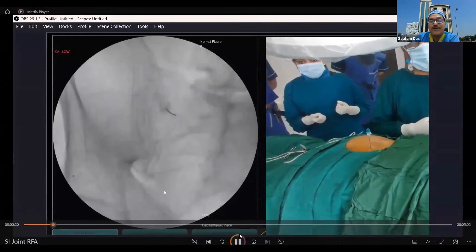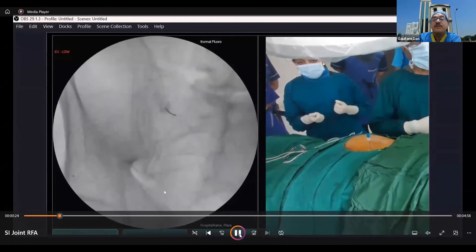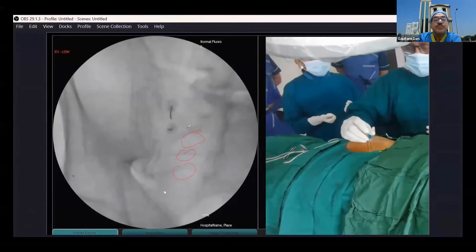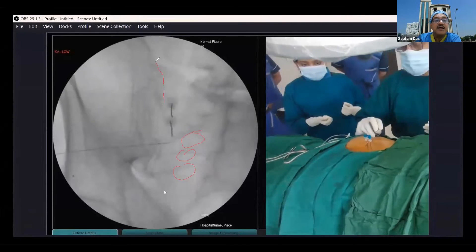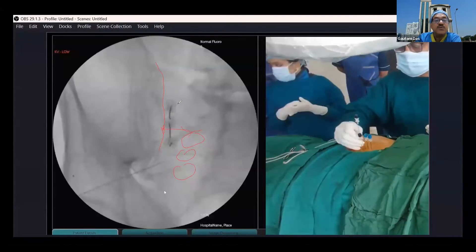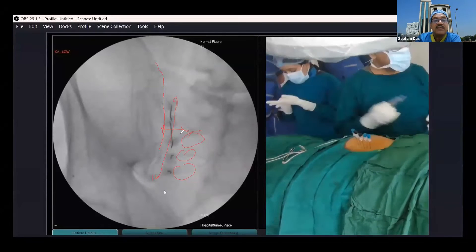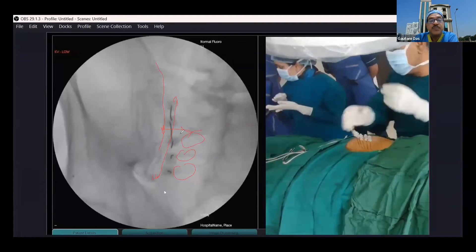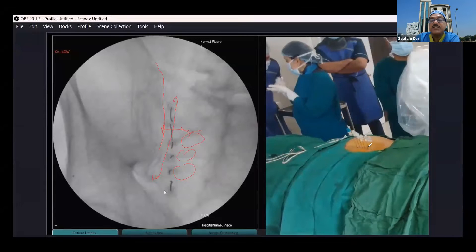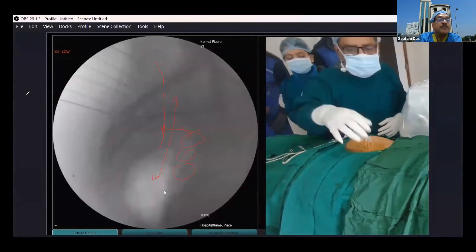First we are doing the procedure on the left side. This is the area — these are the sacral foramina and this is the iliac crest. In the space between these two, we need to place needles from the upper part of the SI joint to the lower part, along the lateral side of the S1, S2, and S3 foramina. We have placed six needles and will be doing the stimulation.